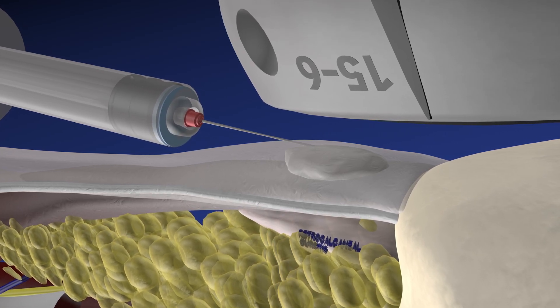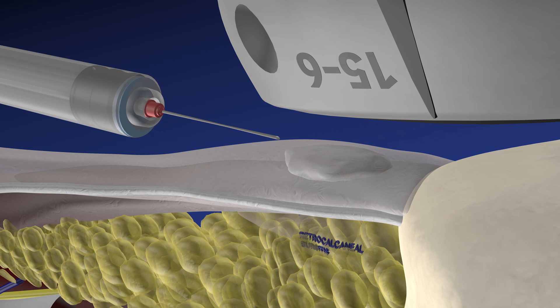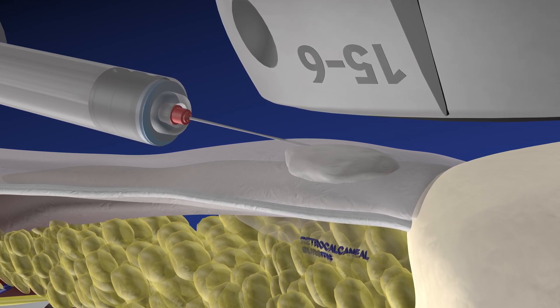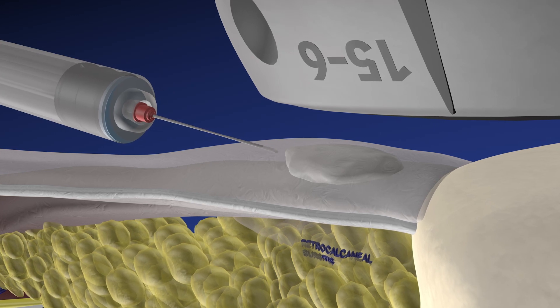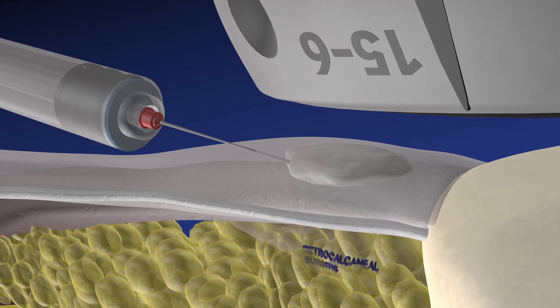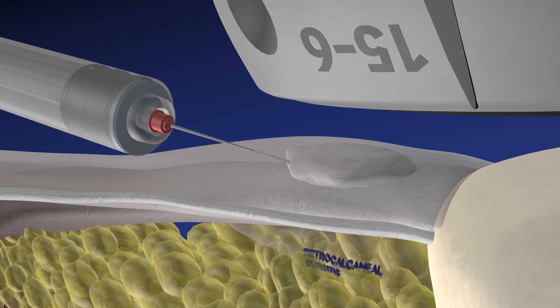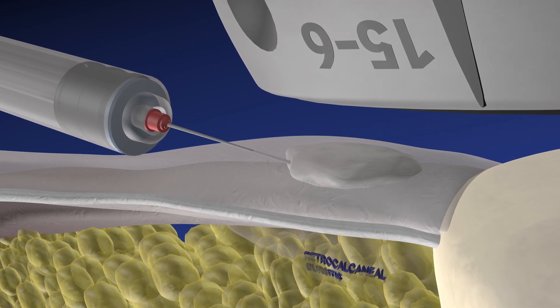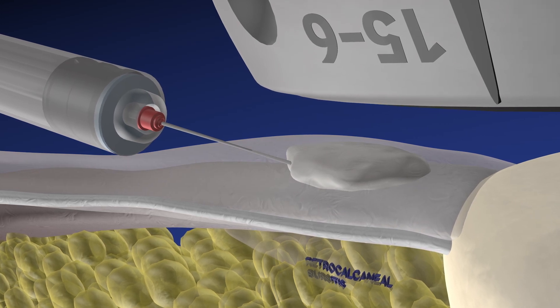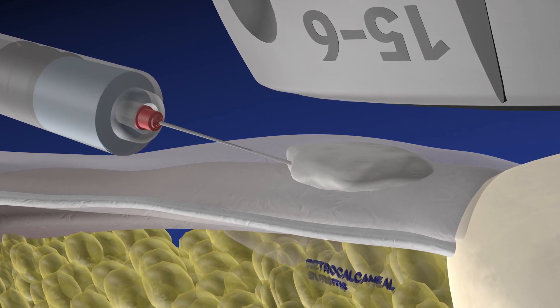Now we're starting the needle fenestration, going in and out of the tendon in line with the fibers and also into and out of this calcific density to try to break it up. During the procedure we actually injected saline and tried to aspirate some of the calcium, but we were unable to do so. You can appreciate the enlarged retrocalcaneal bursa, which is labeled here. Now we're injecting saline within the calcific density itself as another means to try to break it up and help the body resorb it.